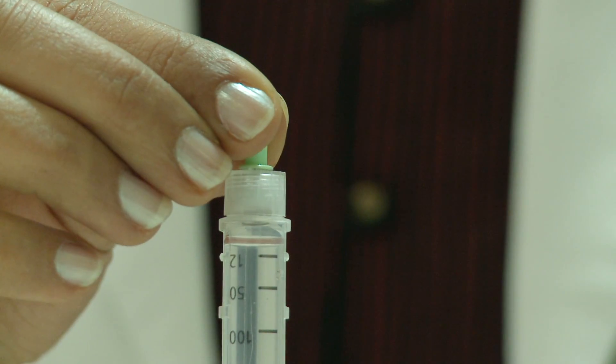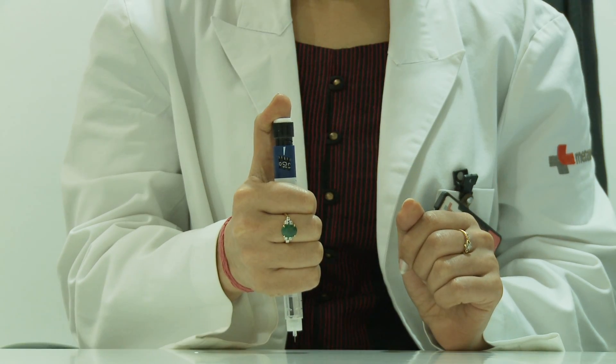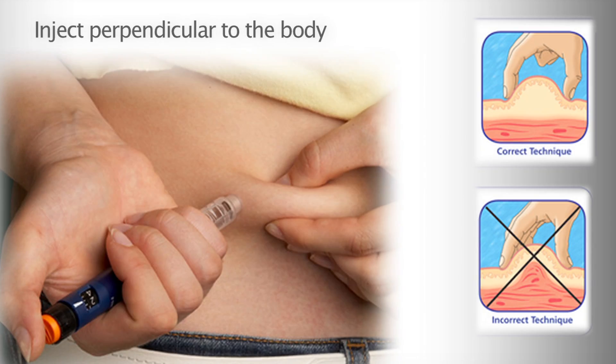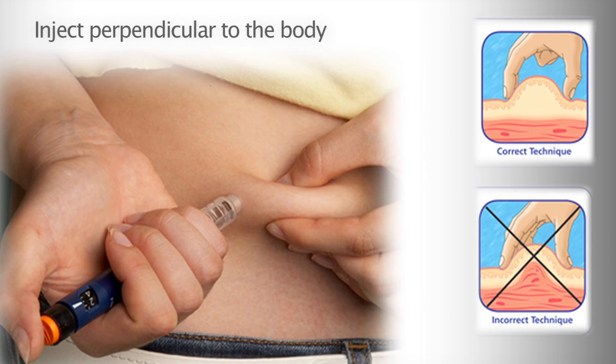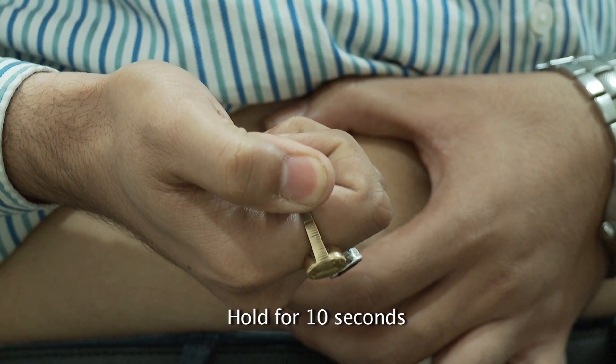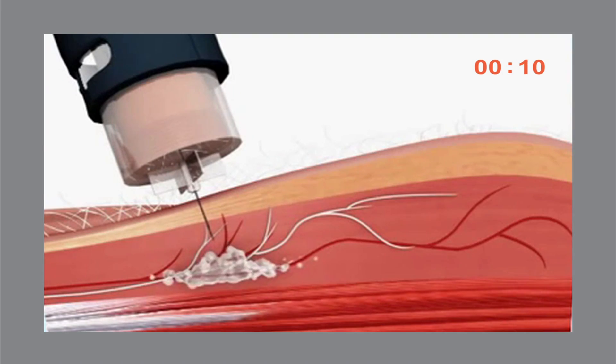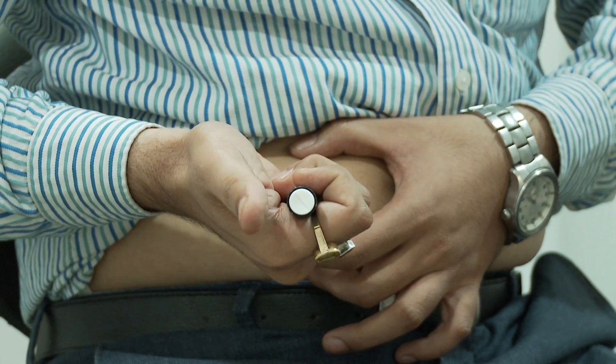Remove the cap of the needle. Hold the pen in a thumbs up position and administer the injection perpendicular to the body. Press the dose dialer till the entire dose is delivered. Hold the pen for ten counts.